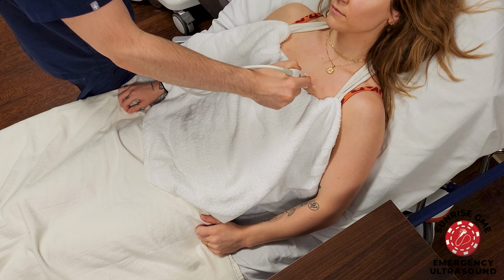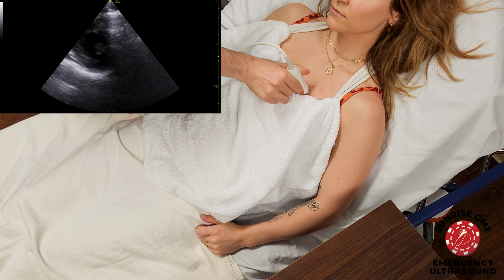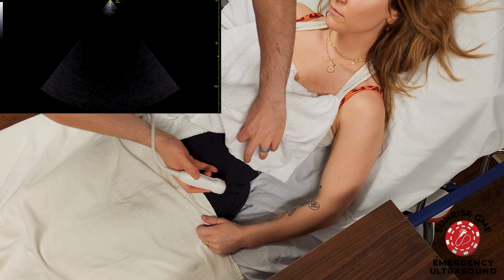When performing this ultrasound on female patients, you will need to adjust your probe movements to account for breast tissue and patient attire. Try to avoid exposing the patient any more than is absolutely necessary to obtain high-quality images.